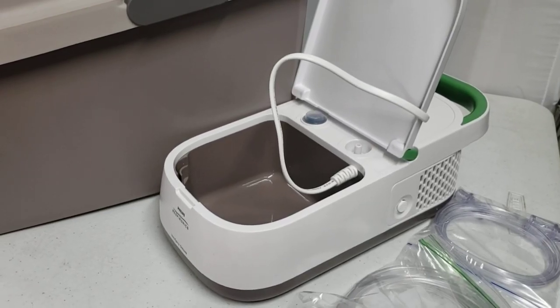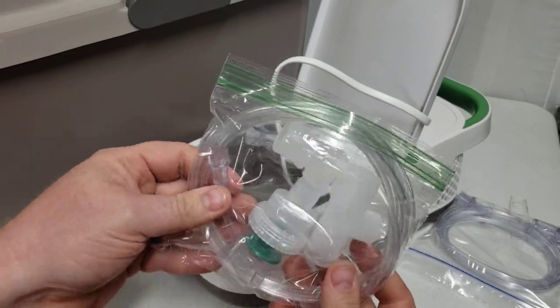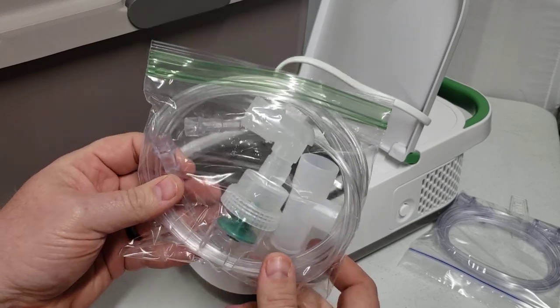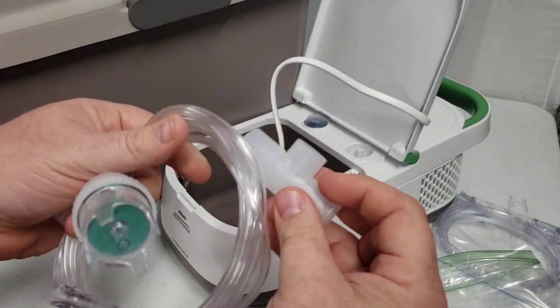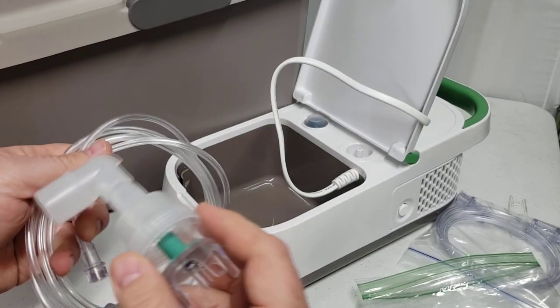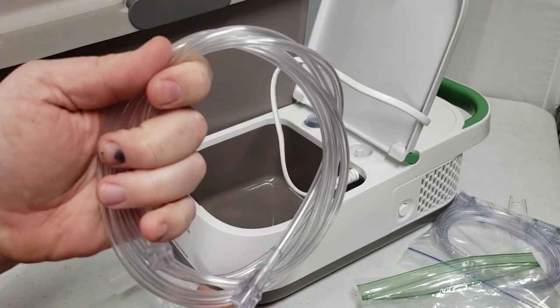I want to start with the nebulizer connection pack. You will need this nebulizer connection pack that's ordered on the website at lifelinepetsupplies.com. Go ahead and open this up so that you can see the contents. We've got a little tea adapter here, and here's a standard nebulizer cup with elbow and tubing for that.